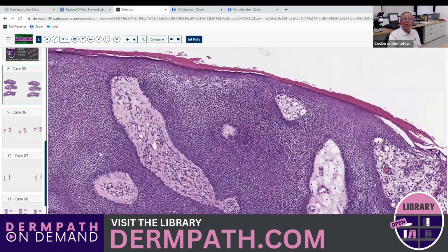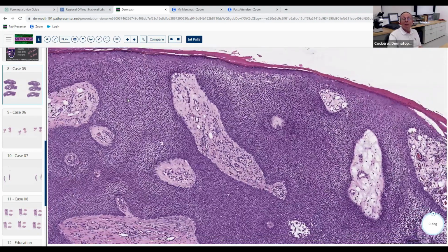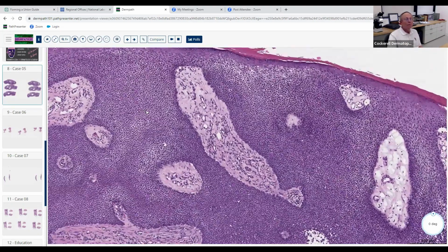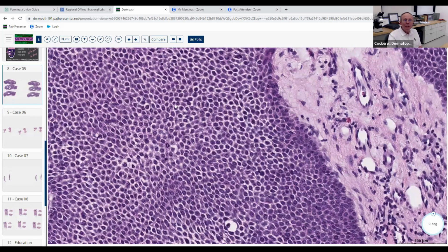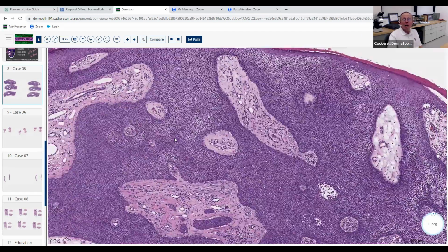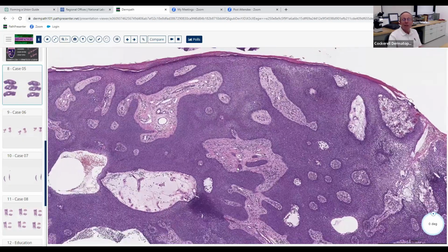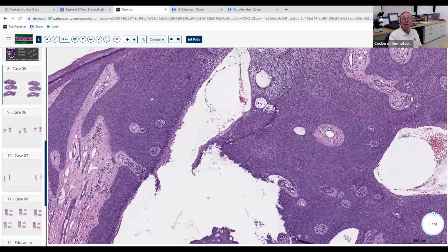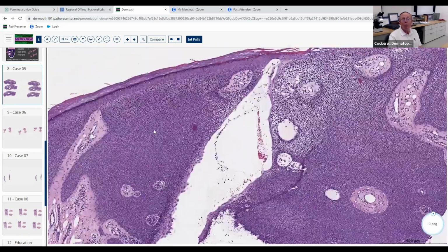So anyway, when you talk about poroid differentiation, you think that it has this very, very monotonous, attack of the clones morphology. All these cells are small, cuboidal, basophilic. They all look just exactly like one another. Sometimes you can actually see areas of necrosis en masse in these lesions, and that's kind of an exception to the rule of where you get necrosis en masse being a sign of malignancy, because it commonly occurs in these poroid lesions.